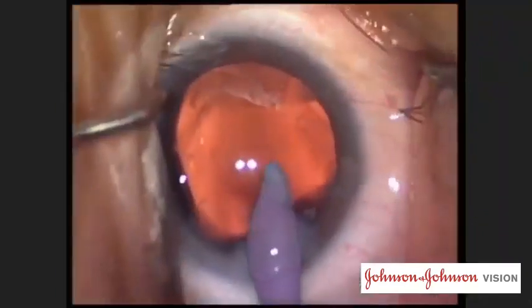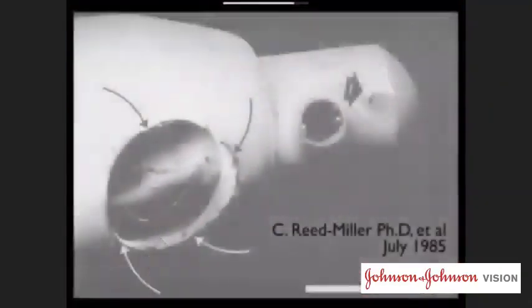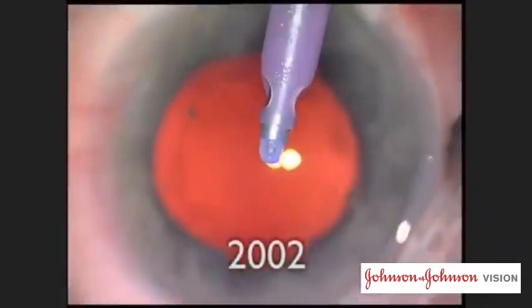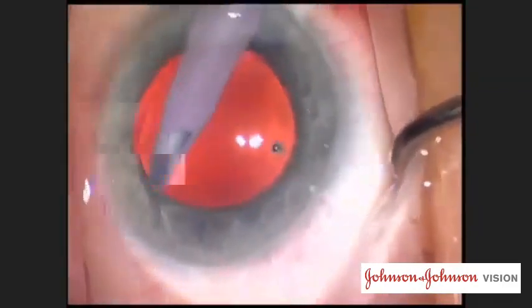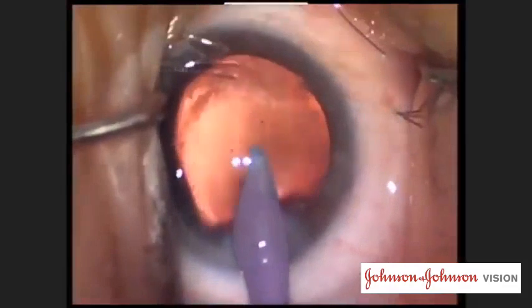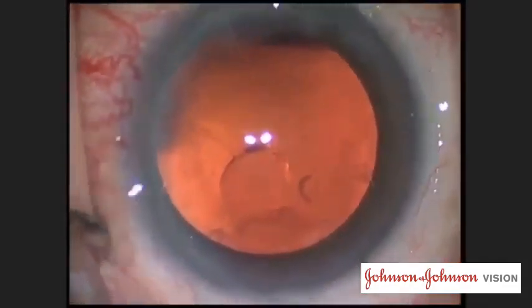Posterior capsular rupture, or PCR, caused by burrs on metallic IA tips, was first described in 1985. Silicone IA tips were released by Alcon in 2002 as a solution to this problem. Since adopting these tips, PCR due to IA was nearly eliminated in our institution. A recent rash of PCR cases caused by reusable silicone IA tips prompted us to investigate.